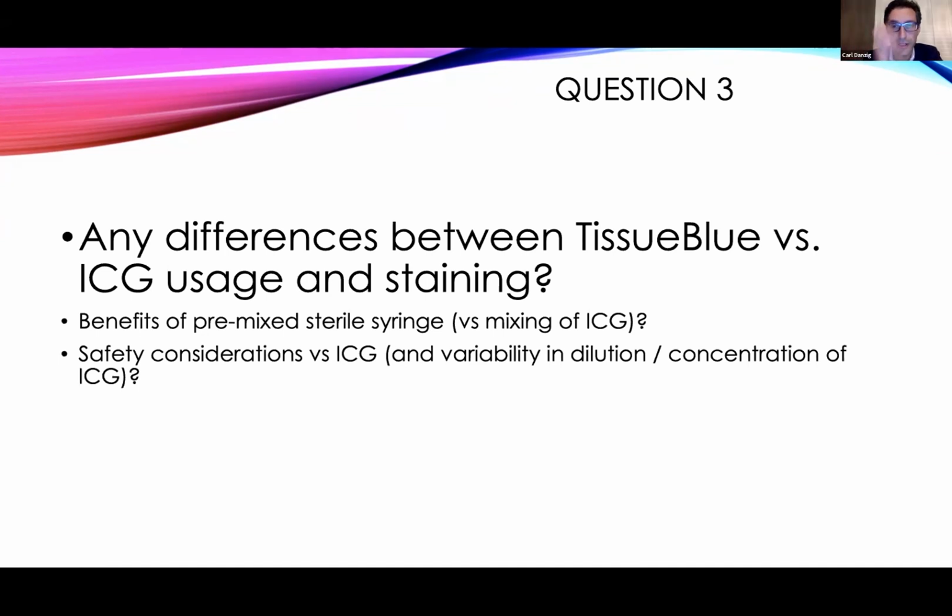Okay, so there are a couple of reasons. It's a great question, Arshad. As we see in the clinic, with our intravitreal injections, we're moving more and more towards pre-filled syringes. Who doesn't want a pre-filled syringe? Just think about it. In the clinic, when you have to draw off a vial and put on the needle, it doesn't take a lot of time, but when you get used to a pre-filled syringe, you realize the fewer steps you're taking and how much easier and smoother it is. Well, that's no different in the OR with your staff. Those nurses don't want to be doing extra steps. They don't want to have extra exposure to sharp objects.